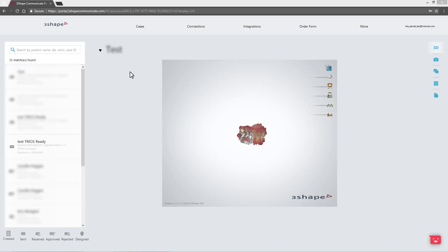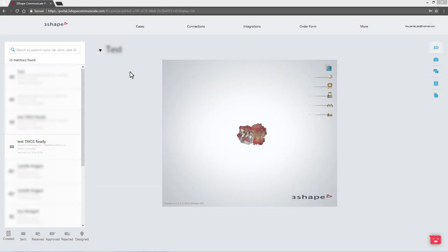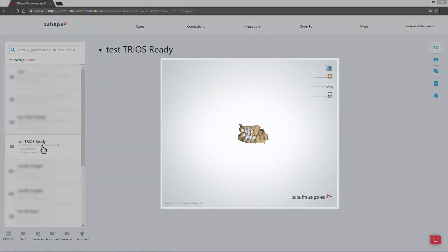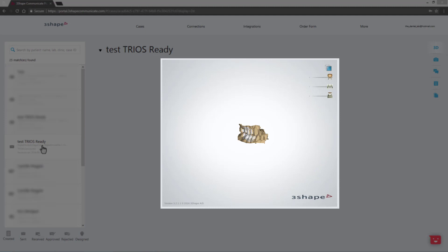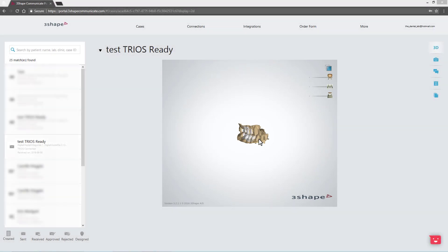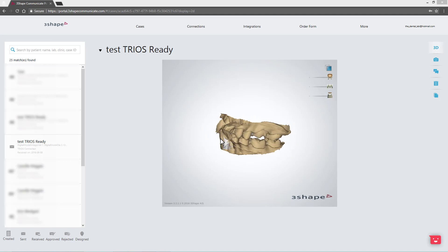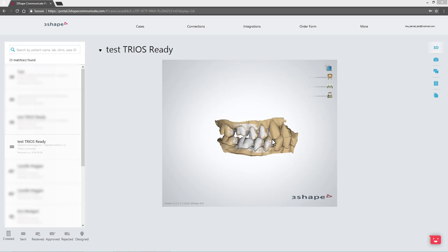When you approve the request, a trial TRIOS digital scan will be sent to you via 3Shape Communicate. In the middle window you can investigate the 3D view of the scan. Remember that you have to integrate your Dental System with the 3Shape Communicate account of your lab.